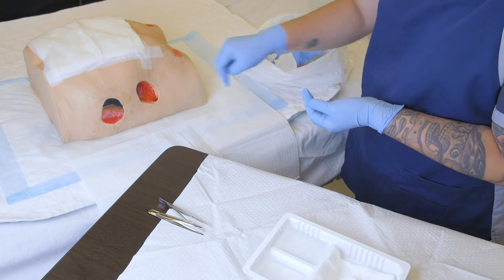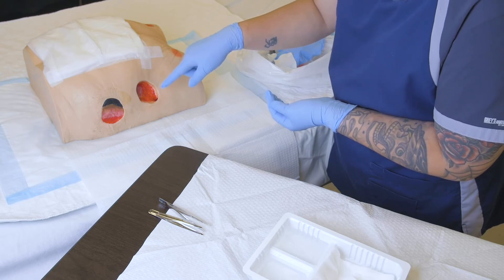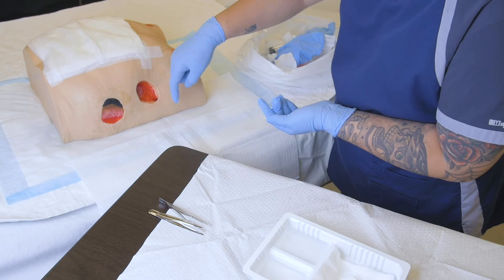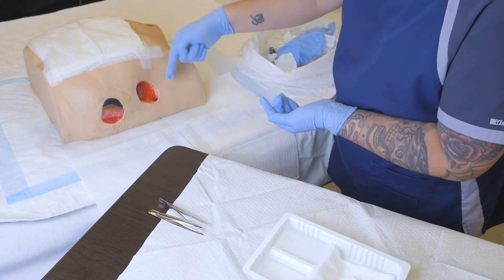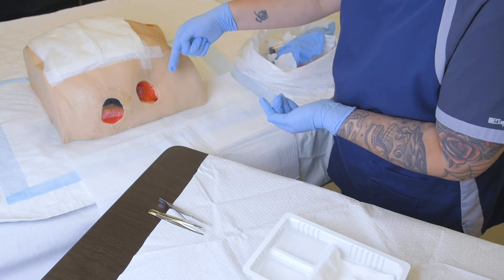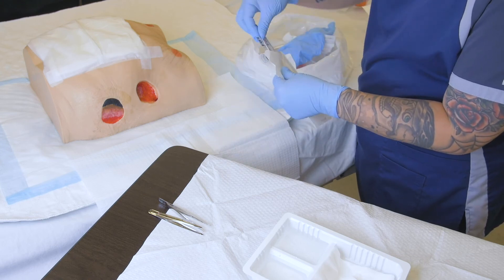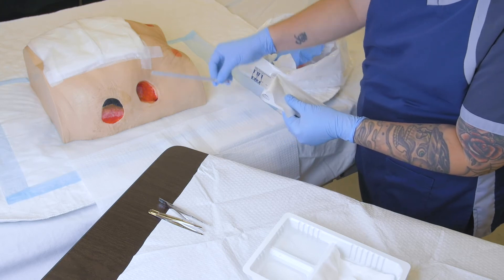Now that we've cleansed and dried, we take the time to assess the wound. We can see pink and red wound tissue, which denotes healing, and a little bit of slough around the 12 o'clock area. We can also see a sinus tract — also known as tunneling — towards the 7 o'clock area, and some undermining between 11 and about 1 o'clock. We note these findings but won't measure those areas as we haven't had the training to do so. We also assess the peri-wound — the edges are intact, not curled over, hardened, or sloping, and there is no erythema or contusion. Here we are checking the length and width of the wound.